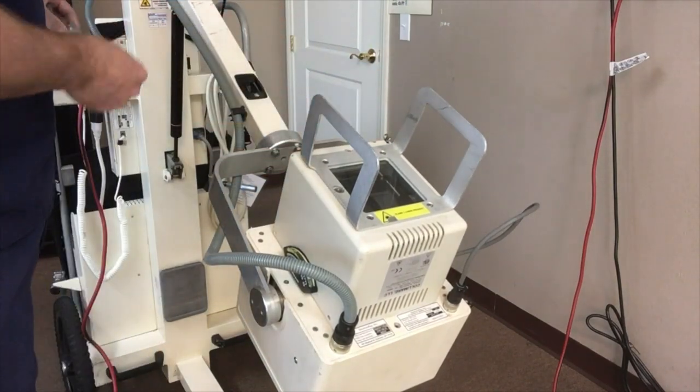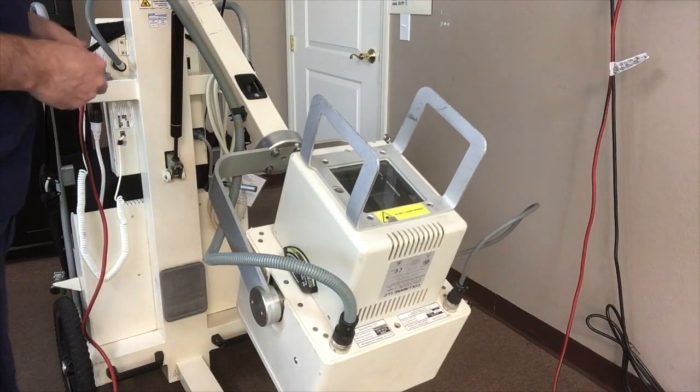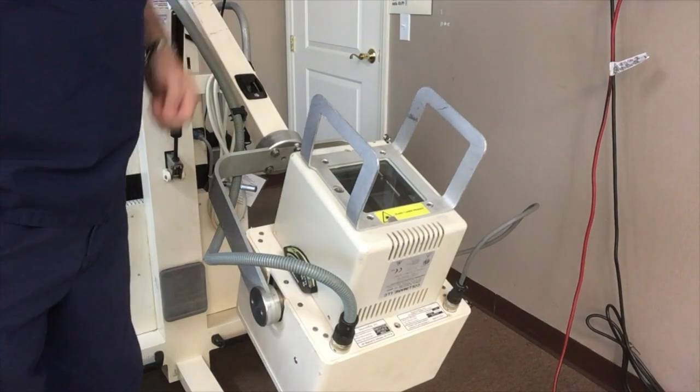You need to remove both knobs. When you reinstall the knobs, you don't want to tighten them too much because the knobs are very brittle and you can break them.